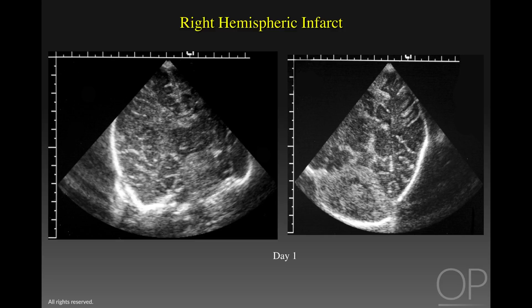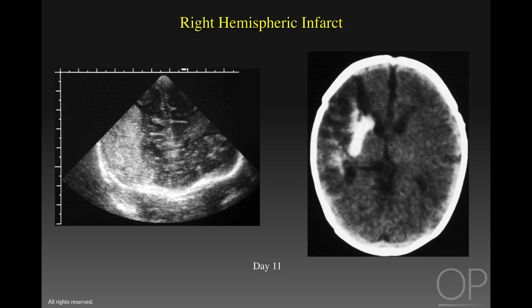This term infant was being treated with ECMO for pulmonary hypertension and developed a geographic pattern of increased echogenicity involving the distribution of the right middle cerebral artery, seen in the image to the left compared to the normal side on the right. This is at day one. By day 11, this lesion has become very dense, with loss of sulcal demarcation and mass effect. On CT, this was confirmed as a middle cerebral artery stroke with secondary hemorrhage.